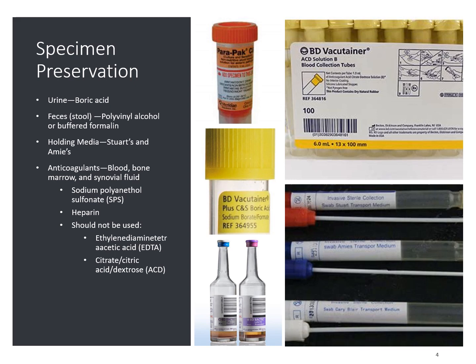Blood cultures typically have some sort of SPS within the bottles that helps to preserve those organisms as well, and to help enhance their growth once it is loaded onto the analyzer.